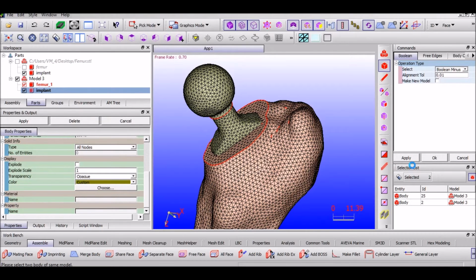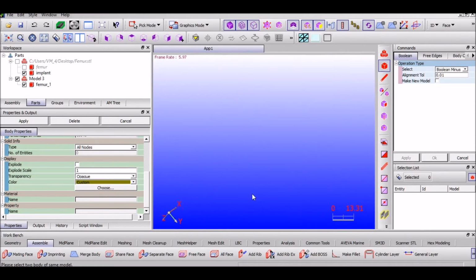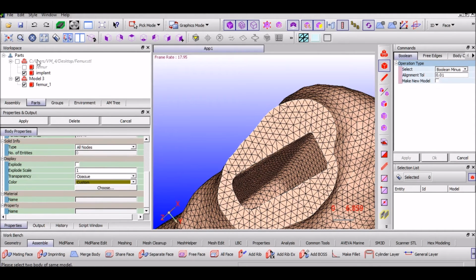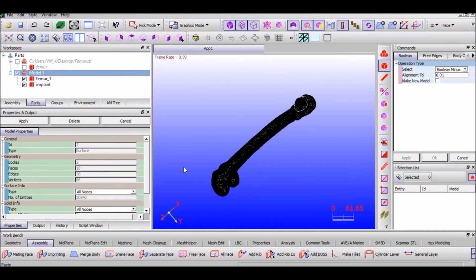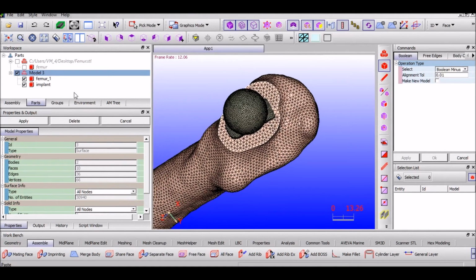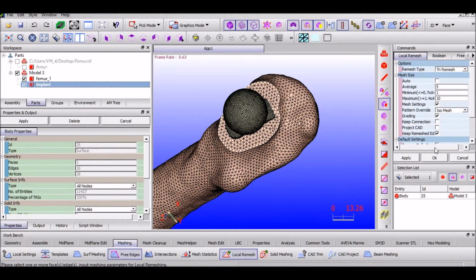Boolean minus has been completed. As you can see, there is a cavity inside the femur where the implant fits. Cut the body from the first model and then paste it in the second model. Hence the implant is fitted into the femur. The implant body needs to be remeshed again.